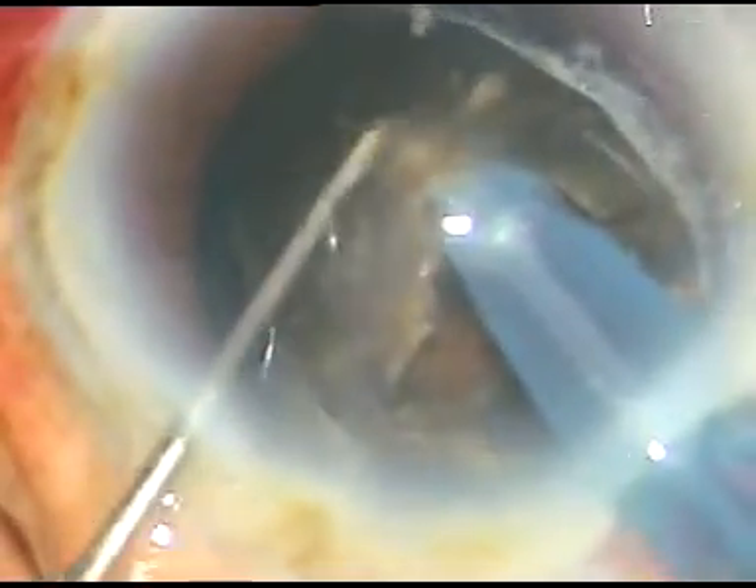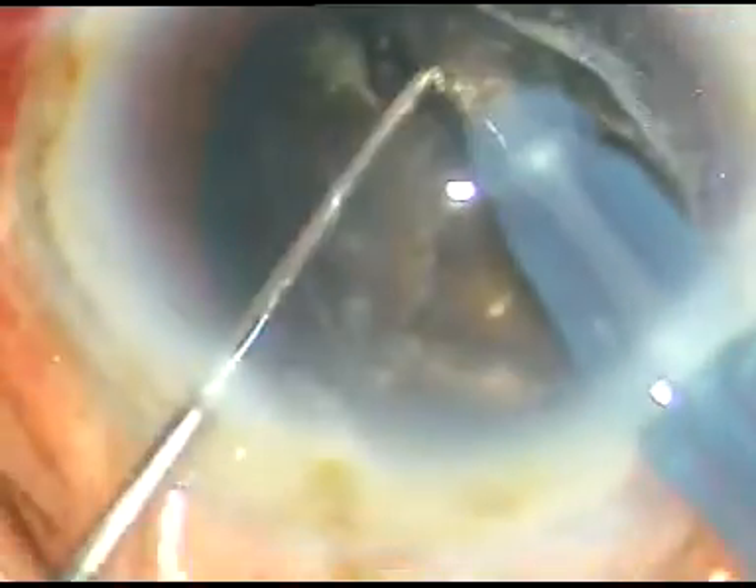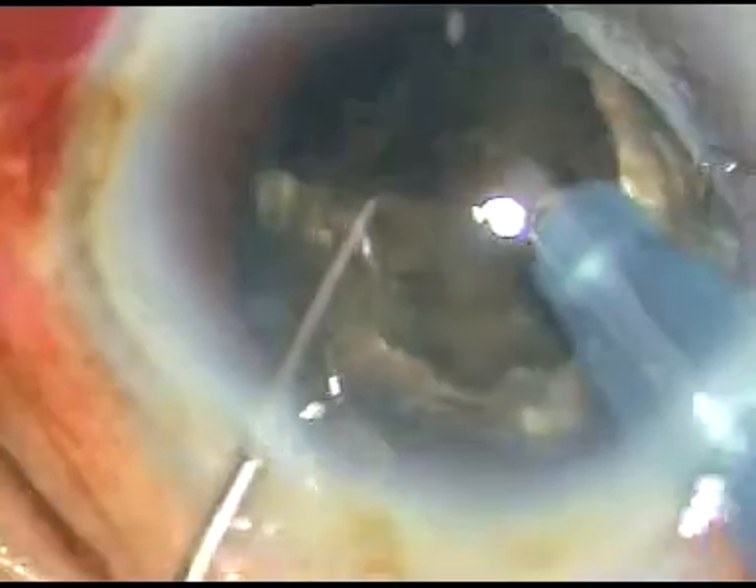Once it divides into two big parts like this, the cataract is almost conquered. Now we must attack from the apex of this very hard nucleus because these triangular fragments are quite large. If we don't attack from the apex, this sharp apex can hit the posterior capsule and can cause rupture of the posterior capsule.